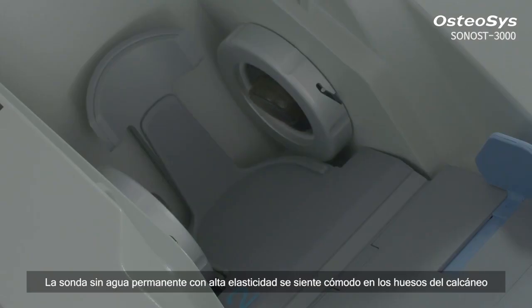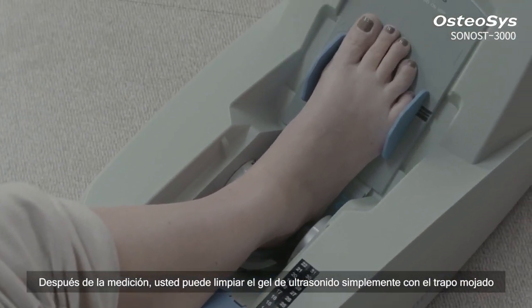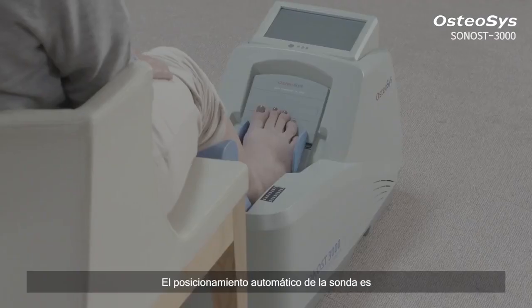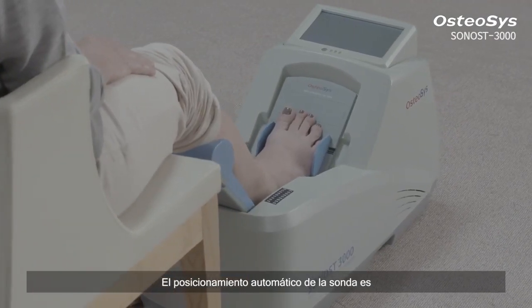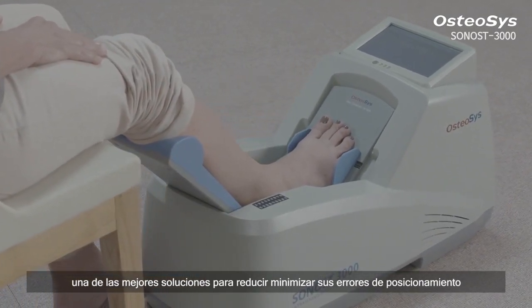The semi-permanent waterless probe with high elasticity makes you feel comfortable on your heel bones. After the measurement, you can simply wipe out the ultrasound gel with a wet wipe. The automatic probe positioning is one of the best solutions for QUS systems to minimize positioning errors.